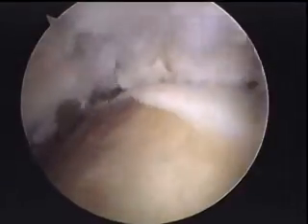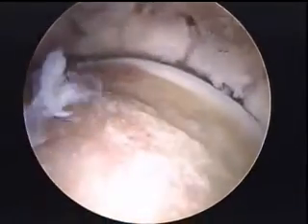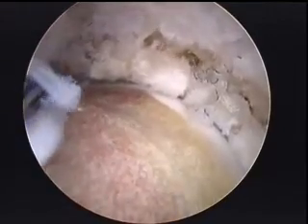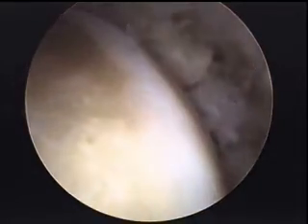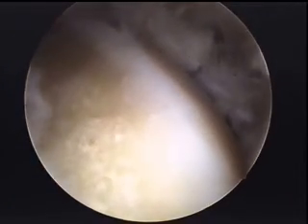The osteoplasty where we've done is down to what we call more cancellous bone, which is where it's red, rather than a harder or sclerotic bone, which is in the area of the impingement. And you can see here again our resection, and that's going all the way out to the lateral side. There's our repair with our anchors from before, where the impingement was before. And now that is resolved. And we're rotating the hip right now as well while he's in flexion to show that we again are not having any impingement. Again, the suction seal there is nicely restored.